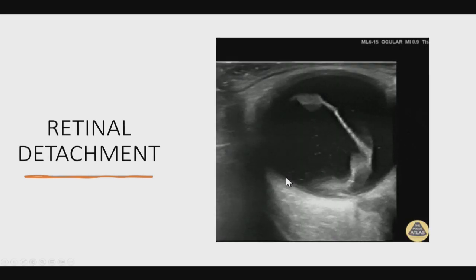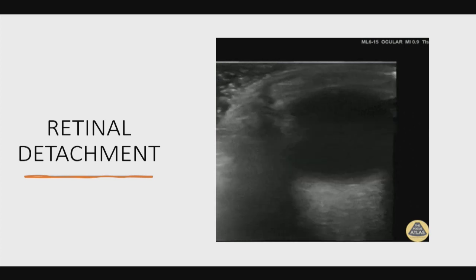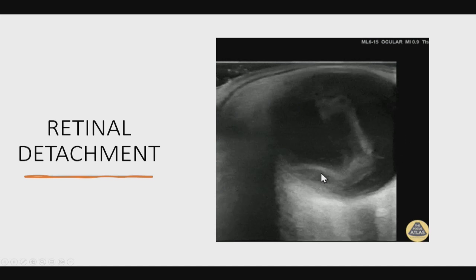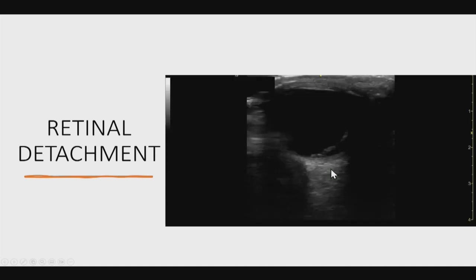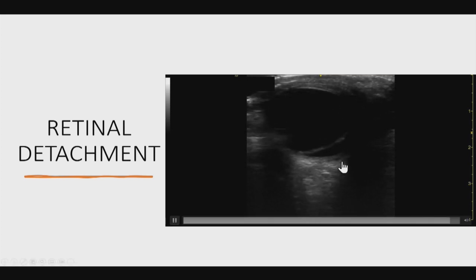This is another example of that. Initially, the patient's eye twitches, and you can see that it is following the optic nerve. And then the ultrasonographer uses the fanning technique. You can also see some floaters going around. So this is another case of retinal detachment. As you can see again, it's wonderfully attached. It's nice and thick, and it's attached to that optic nerve.